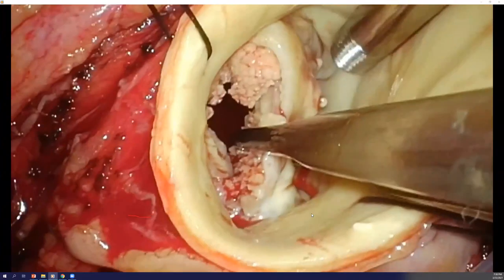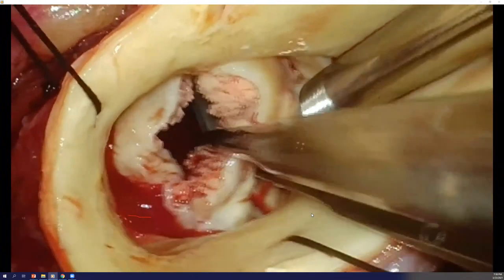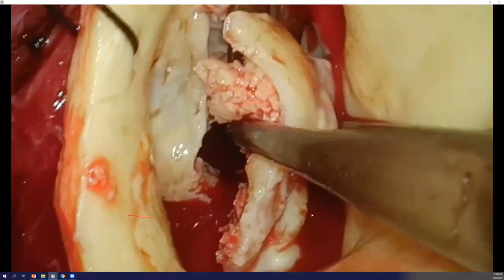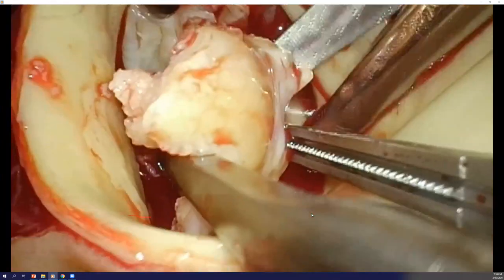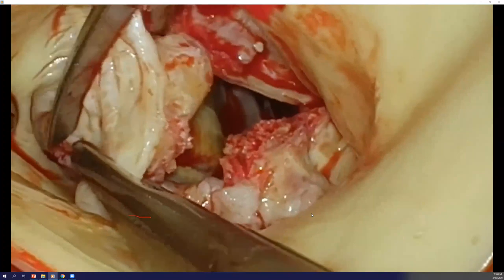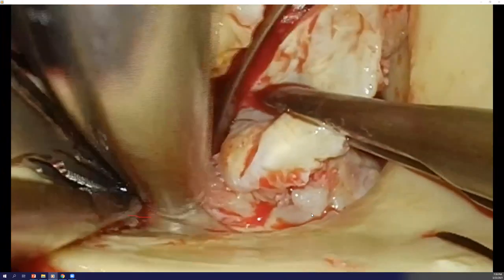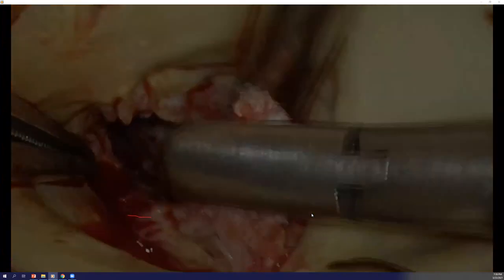You see, this is a very heavily calcified type zero bicuspid aortic valve. Both commissures are almost at 180 degrees. So definitely a non-repairable aortic valve. Repair would always be plan A in any patient. So it's important to get the leaflets out and to thoroughly decalcify.